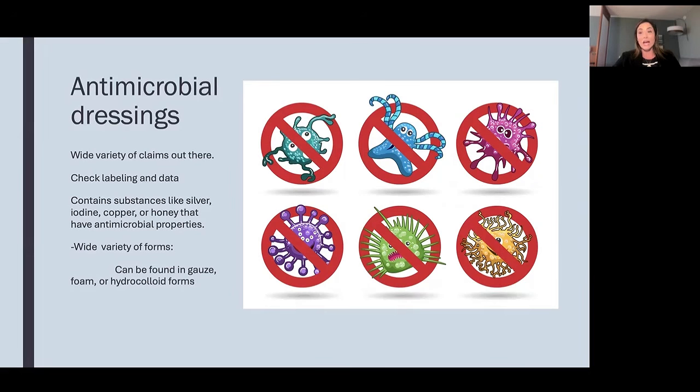Some can actually be toxic to the wound. And some can really truly address the bacteria that's within the wound. So every antimicrobial product is going to have its own set of specific claims that it can make. My recommendation is that you always know what the manufacturer says about their product, what claims they can make, and use it as a tool in your toolbox.